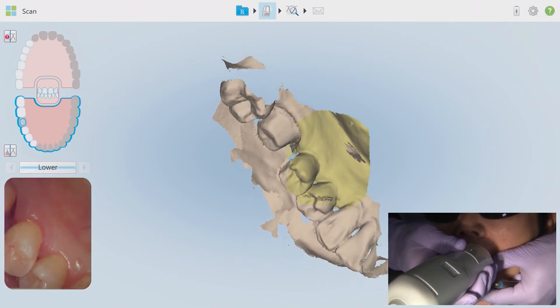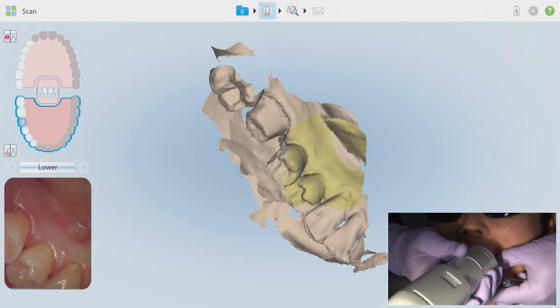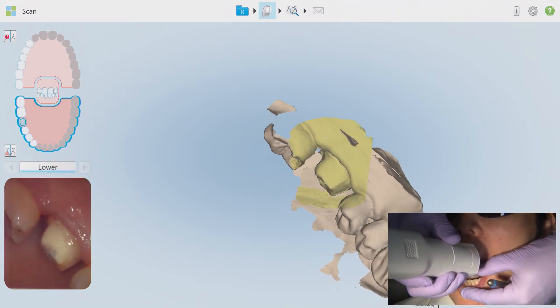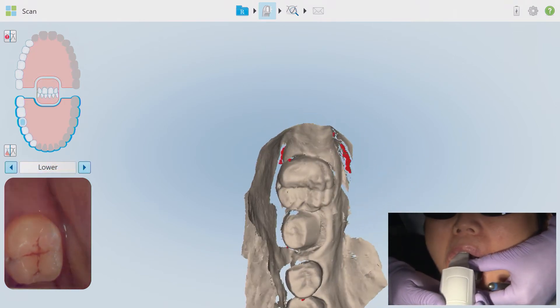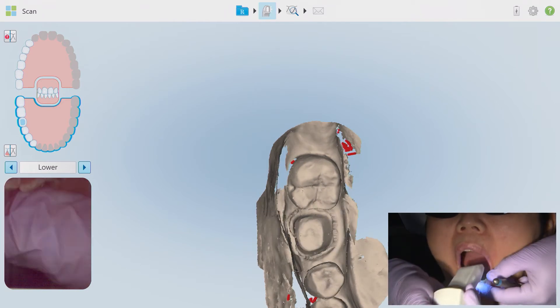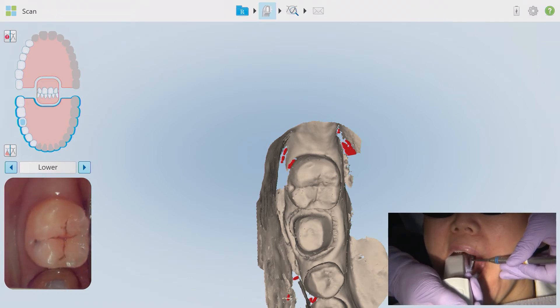Take a good look at my hand position here — I'm still using an underhand grasp with my fingers facing upwards, making exaggerated bold purpose-driven twisting movements in order to capture these difficult-to-reach embrasure and contact areas. If you are having trouble acquiring interproximal anatomy, first check for saliva contamination and then increase the angles of your exaggerated twisting motion. Once I reach my start point just distal to the most posterior tooth in this arch, I'll stop the scan and reset for the buccal anatomy.